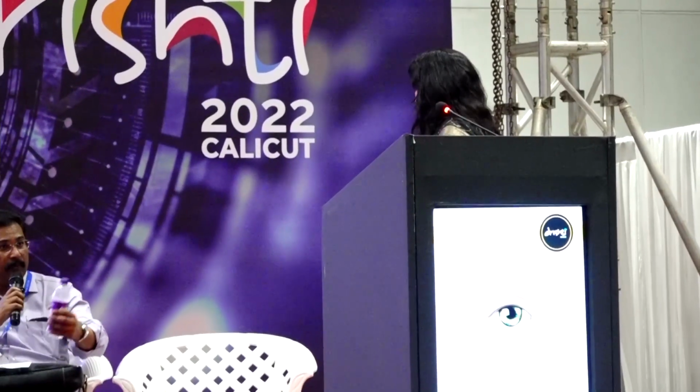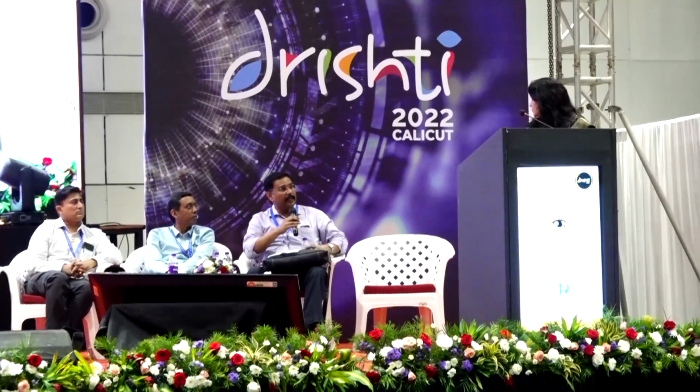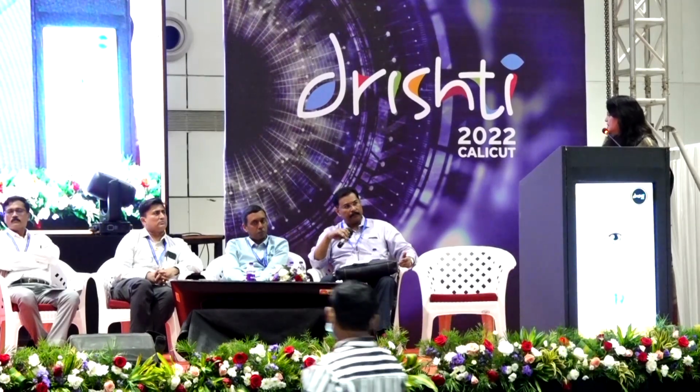Thank you very much, madam. One query on this. Which all microscopes can this be attached to? Will it go on any microscope? As of now, it is integrated into the operating microscope. So the Zeiss microscope has it, but I know that there are others also. In fact, even the Appasamy microscope now has this intraop OCT attachment, which they're trying to make. So there are Indian companies also which are trying to make it, but this is on the Zeiss microscope.